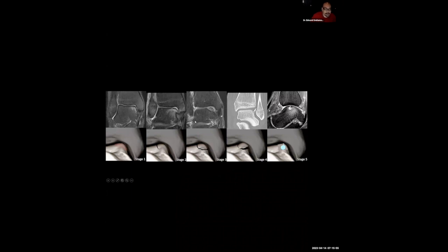So let's dive into some of these fractures, okay, starting with some dome compression fractures, which is actually the most common talar body fracture, okay? Impaction is generally the accepted mechanism of injury, okay, resulting in damage to the articular cartilage and subchondral bone, okay? And these fractures can unfortunately be occult in about 25% or so of cases radiographically. Lateral lesions, okay, tend to be symptomatic, shallow, okay, and wafer shaped, and are typically thought to occur after inversion injury with or without dorsiflexion, okay.